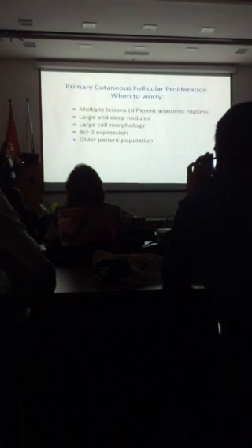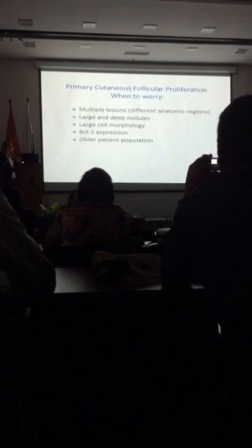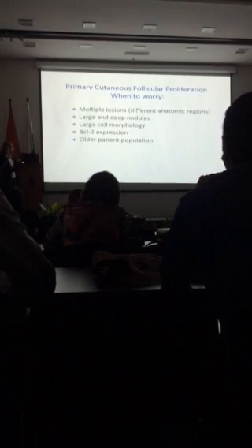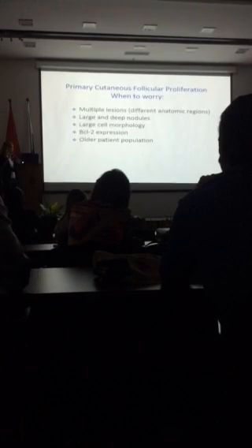So when we have to worry, we do need to do staging, but multiple lesions may point to more aggressive disease. You see large and deep nodules. You see more of the large cell morphology and the BCL2 expression. It's generally in the older patient, but if the patients are really 80 years and older, we are still more worried.